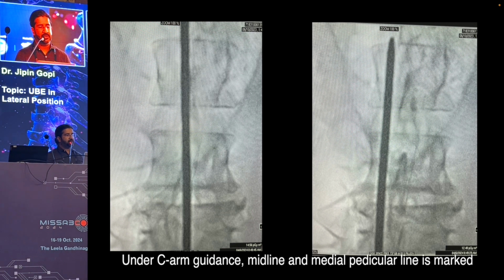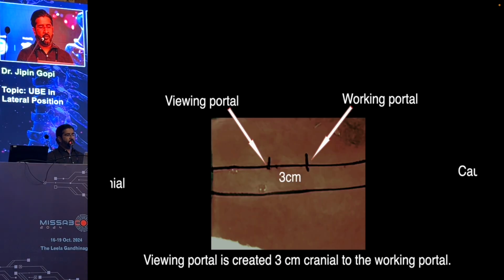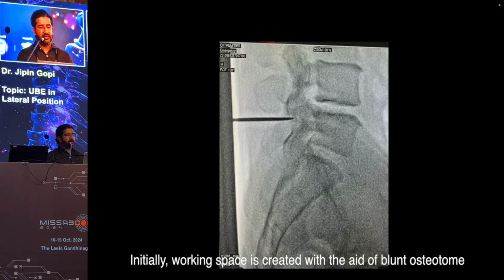Under C-arm guidance, the midline and medial pedicular line are marked. On lateral projection, the working portal is created in line with the lower endplate. The endoscopic portal is created 3 cm cranial to the working portal. Initially, the working space is created with the aid of a blunt osteotome.